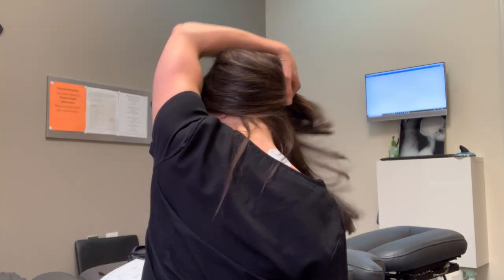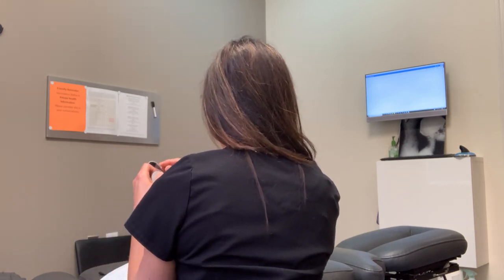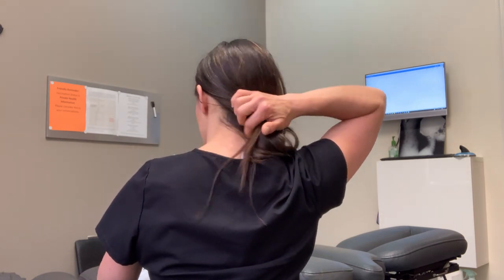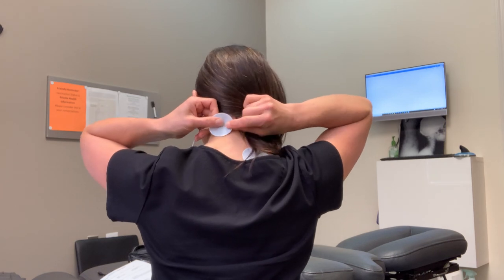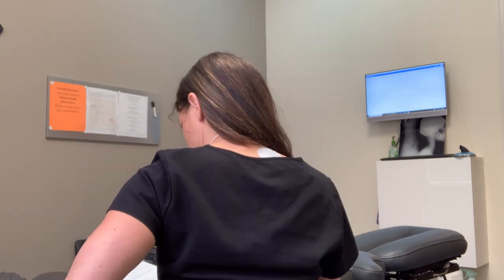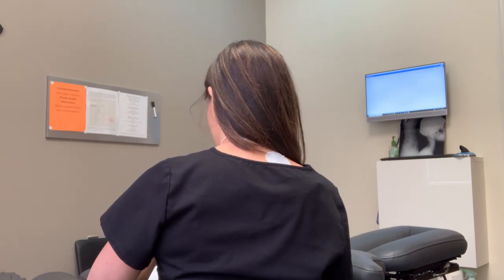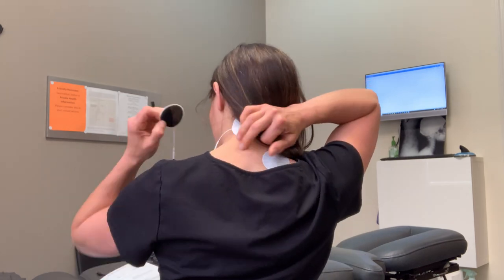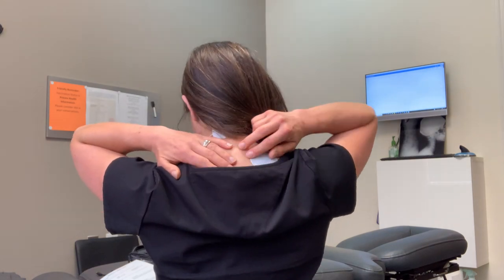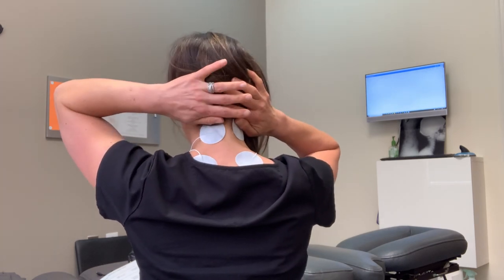Move your hair over and now set the black leads up on the other side of the neck. Pull from the pad side, move your hair, and place this one as equally as you can — they should be pretty level. Then put the lower one on as well. That's the placement for a cervical NMES.